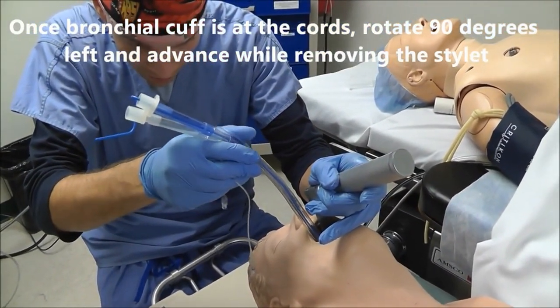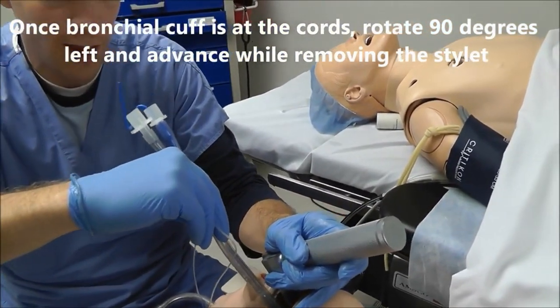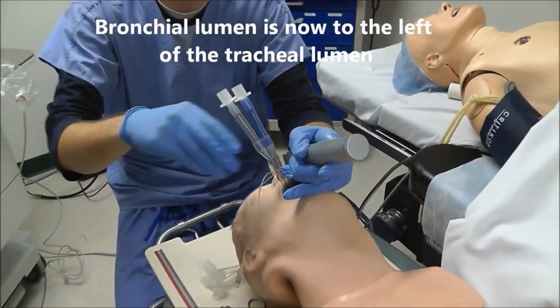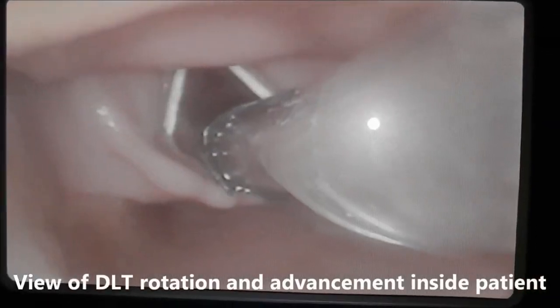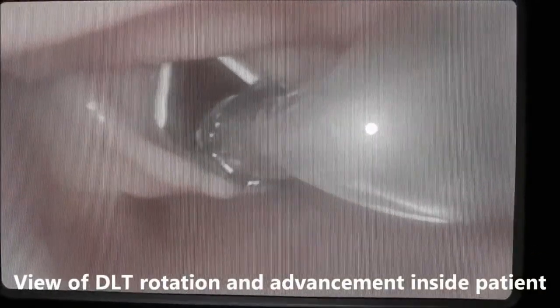And then two things need to happen. We need to rotate this tube 90 degrees to the left and have an assistant remove this stylet for us as we advance into the trachea. On the view from the inside, you can see that once this blue cuff is at the level of the cords, we rotate that tube to the left and have an assistant remove the stylet as we advance into the trachea.